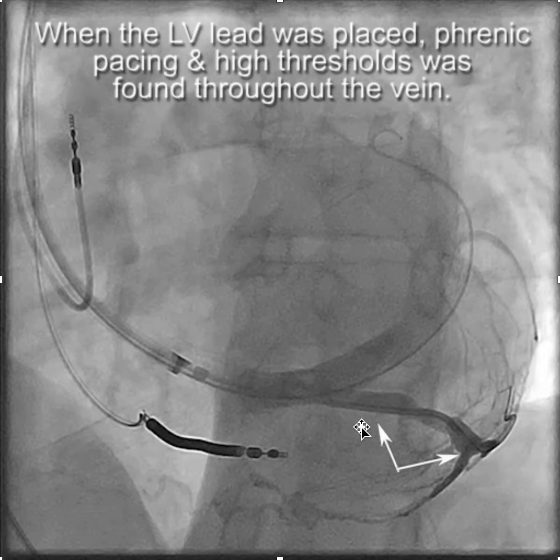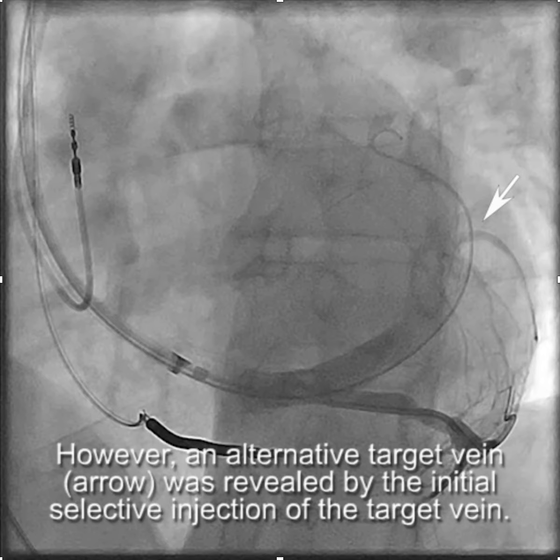When we put the lead in, it turned out there was phrenic pacing and high thresholds all along the vein, despite using a quadrupolar lead and positioning the lead in the various branches and sub-branches. Fortunately, we had noted an alternative target vein identified by the initial injection of contrast through the vein selector — one we didn't see on the selective venogram.